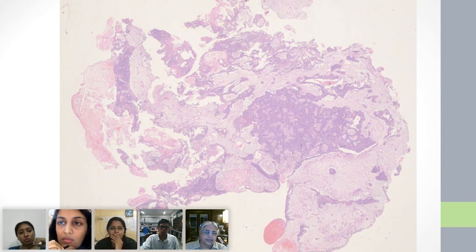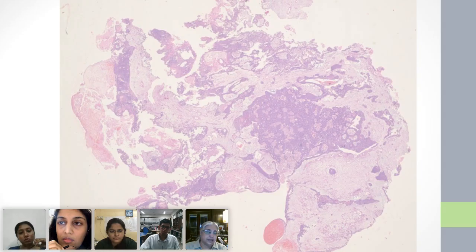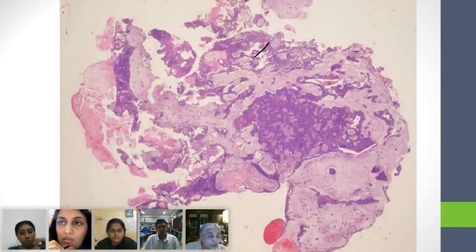Here is this lattice-like structure, and there is another seen here. You can call it a reticulated structure, which is nothing but a net, or network. That is what reticulation is.